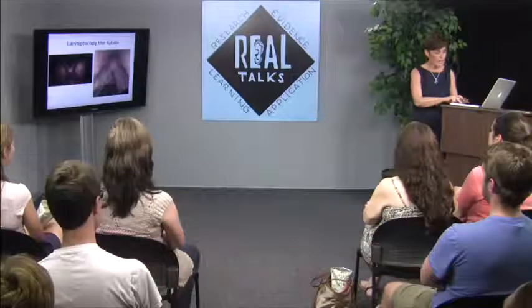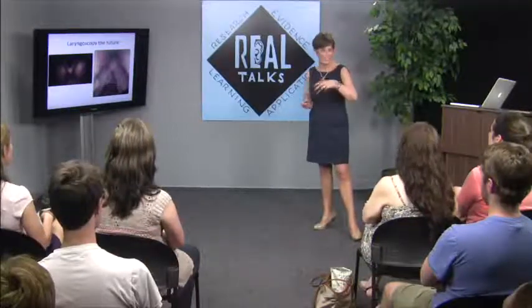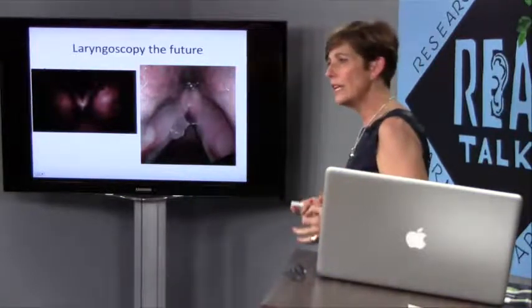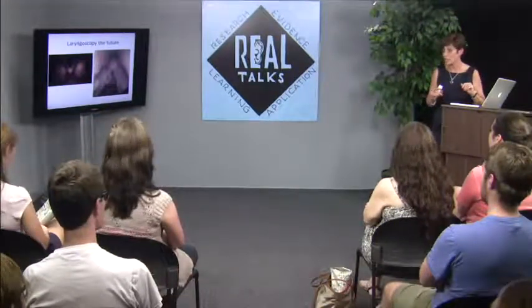This is another technology called narrowband imaging that has made it to the operating room but hasn't made it to the clinic yet. And narrowband imaging, you see the little bits of green in there? That's not green dye like a FEES exam. That's actually a color spectrum. So narrowband imaging, by utilizing different color spectrums, allows us to see the vascularity within the vocal fold tissue and within a lesion that far surpasses any other method of us looking at the vocal folds with the naked eye or with video stroboscopy. And so it's made it to the operating room because it helps with diagnosis and it certainly helps with excisions of different lesions. Another technology I think will make it to the clinic soon.